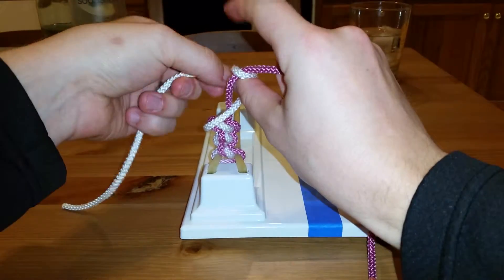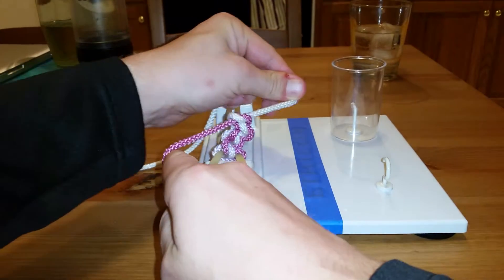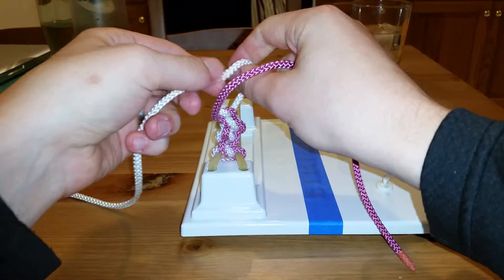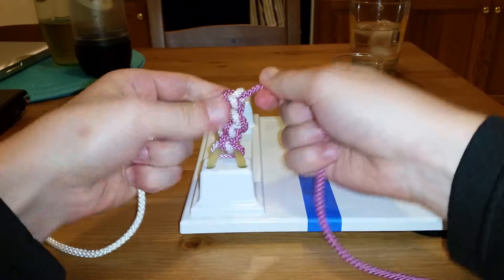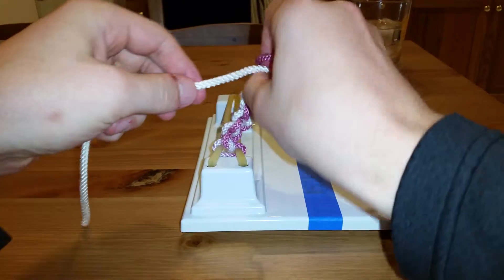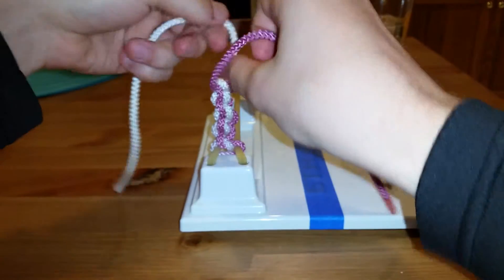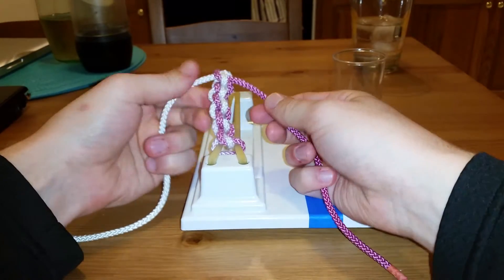Two-handed knots: index finger wrapping the left hand around, bird's beak through the knot, grabbing, come back. Wrap the left hand away from us because the right hand is the business hand. Same thing but reverse — wrapping on the thumb, bird's beak, come back, wrap it down through, nice and tight. And the last knot: index finger wrap it around, through, come back down, thumb bird's beak, come back through.